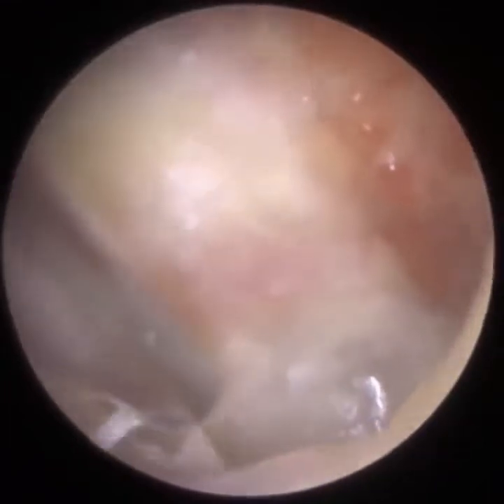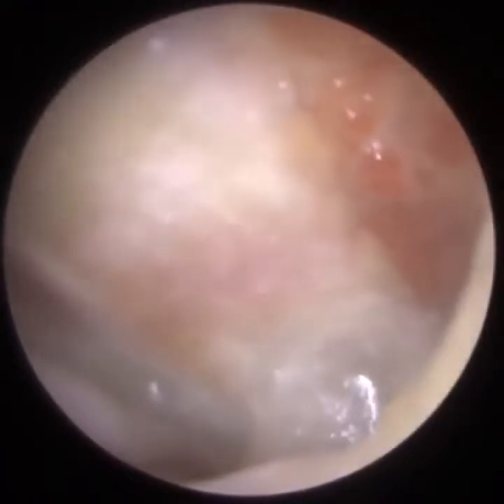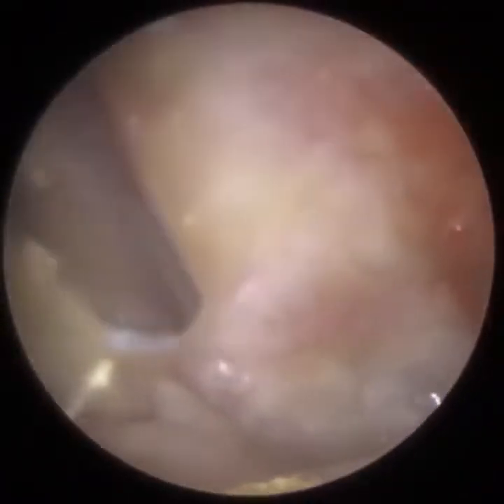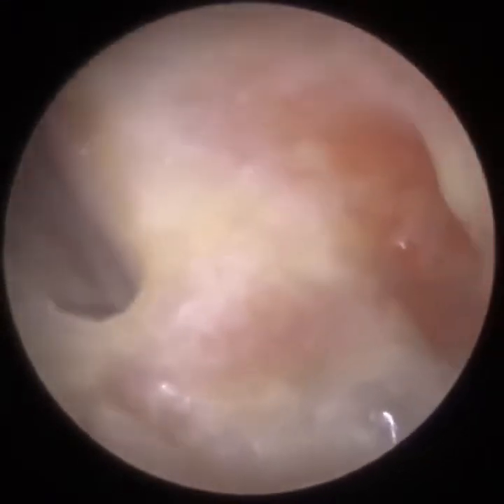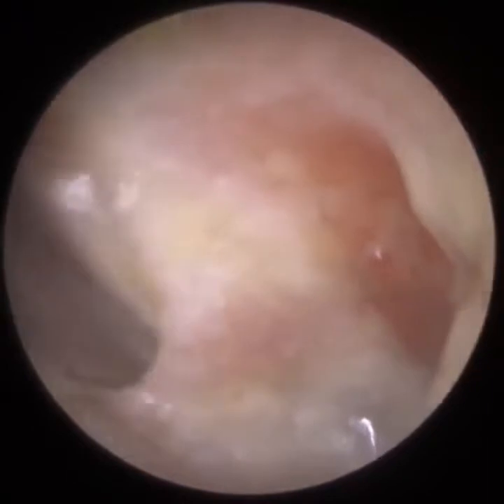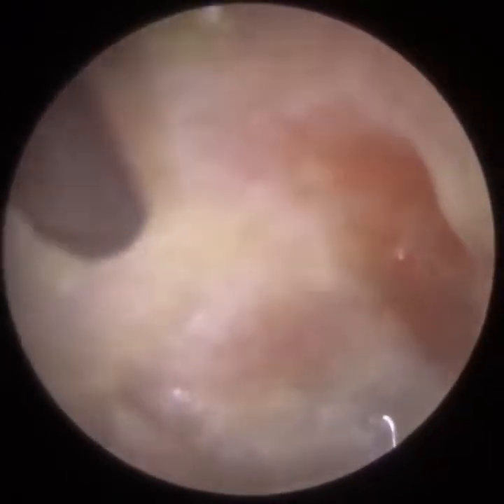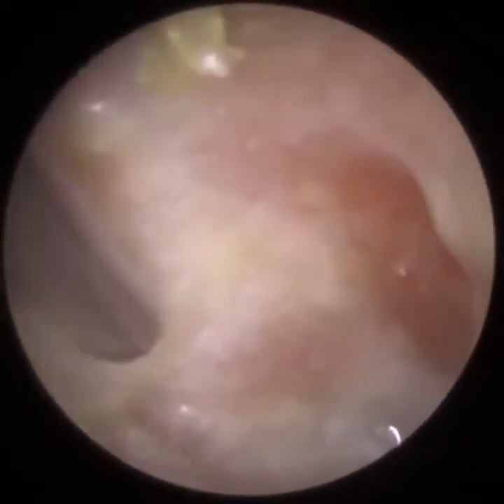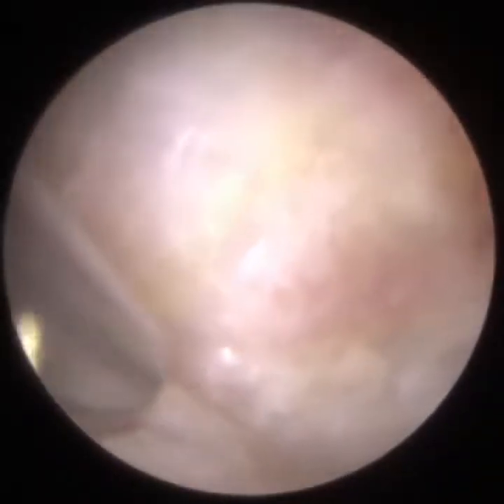It's quite a tedious procedure. We're trying to remove layer upon layer of dead, wet, infected skin from this patient's eardrum and ear canal. Sometimes with dead skin like this, you just hover the suction probe over the eardrum and the dead skin just comes out. But in this patient's case, it doesn't. We have to go through the process of peeling it, getting the edge of the dead skin, finding that first, and then peeling it away.